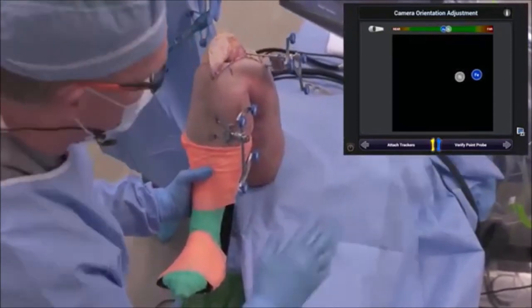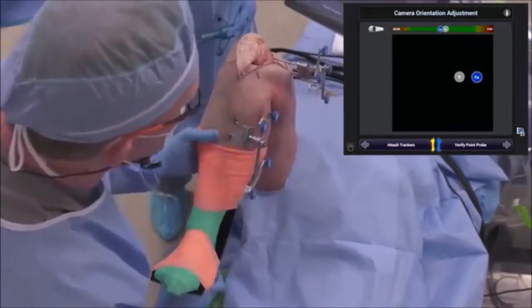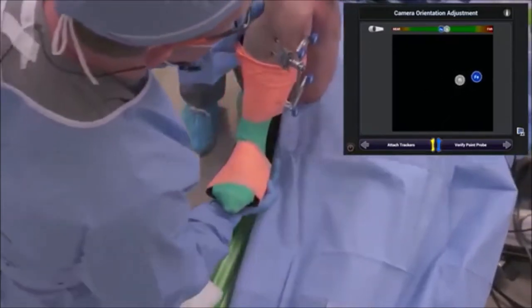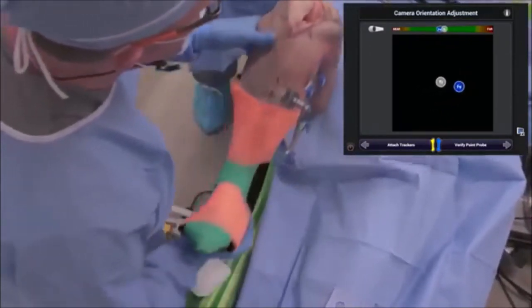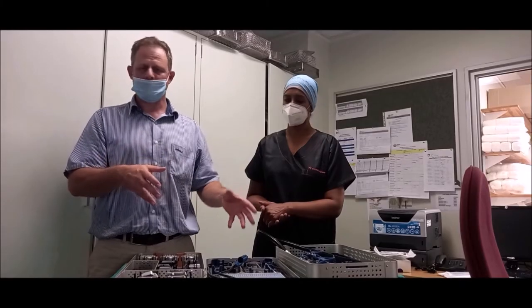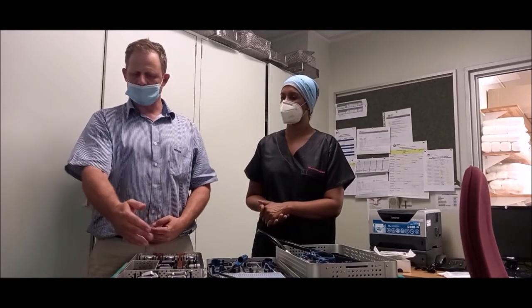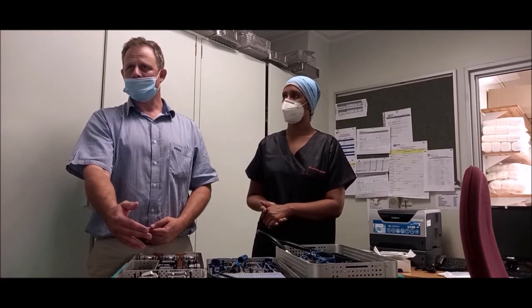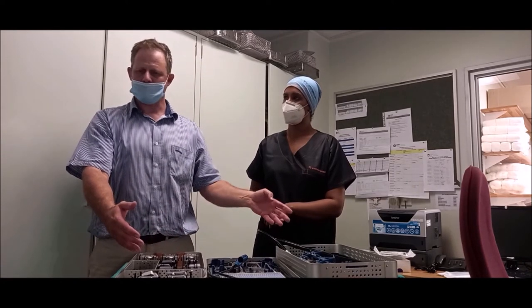We need to ensure that our camera is well positioned so that the sensor arrays are detected by the camera as the knee is brought through a full range of motion. That's just a verification step. If the system fails, we can always revert to the manual checks — it's not that we are completely reliant on the robotic system.